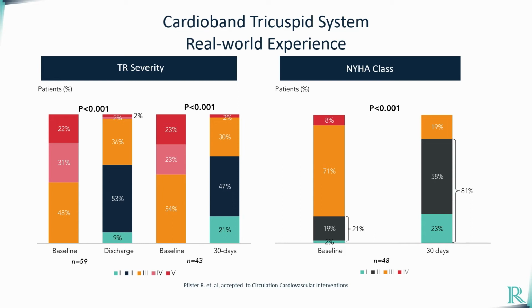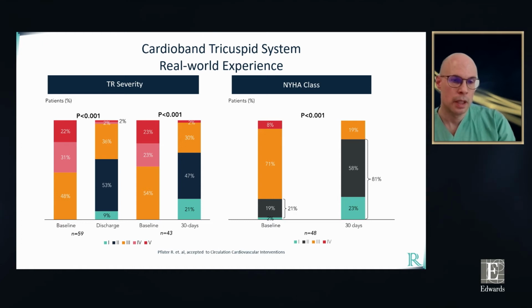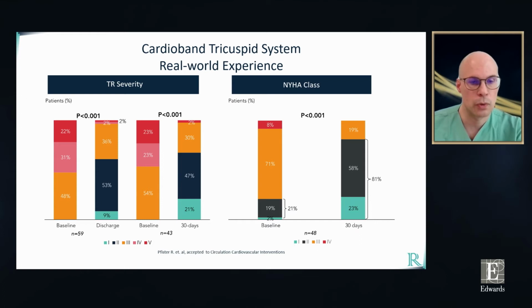So I think it's important to have this technology on hand. You choose the right patient. I think it might be a good technology with the philosophy of treating the annulus.